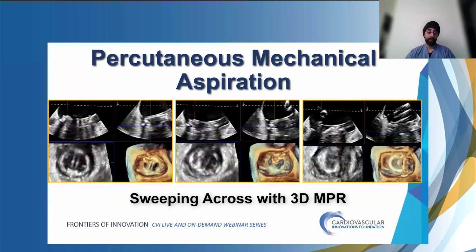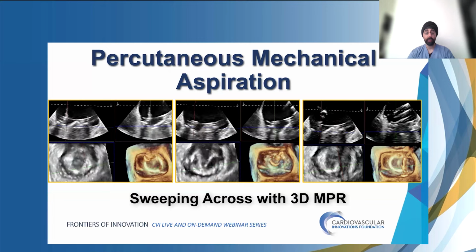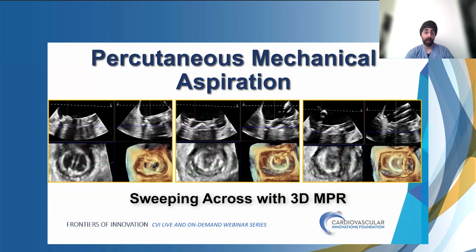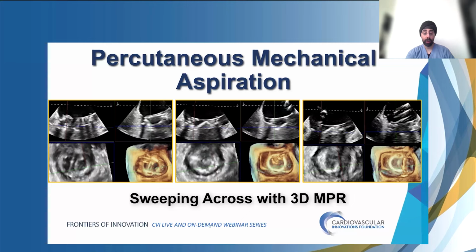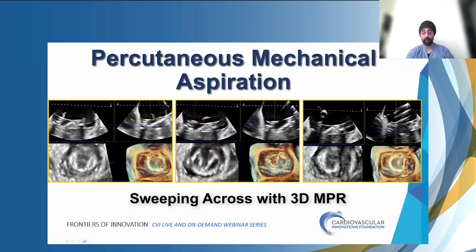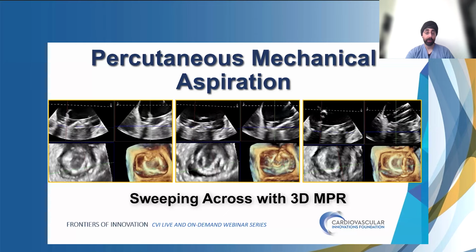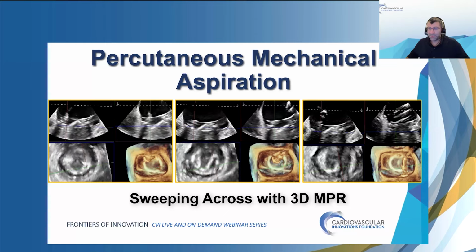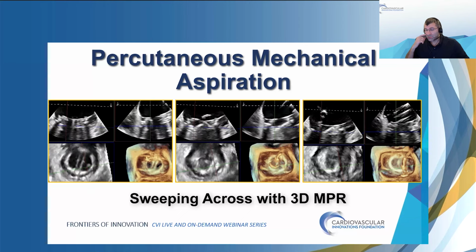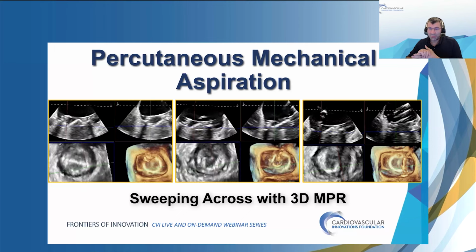No, I absolutely agree. I think adequate positioning is so vital, right? Because it's one curve. You can go from 180 to 10, but it's only in one direction. So if you don't have the appropriate length, you're going to be too curved. So definitely. Exactly.